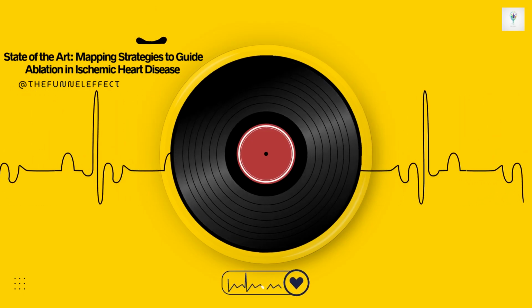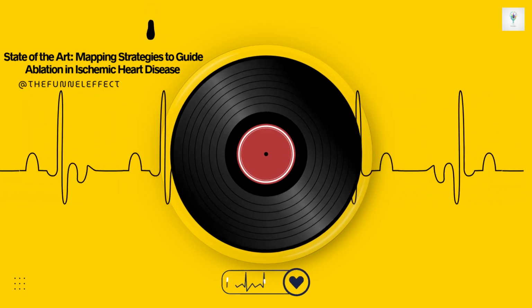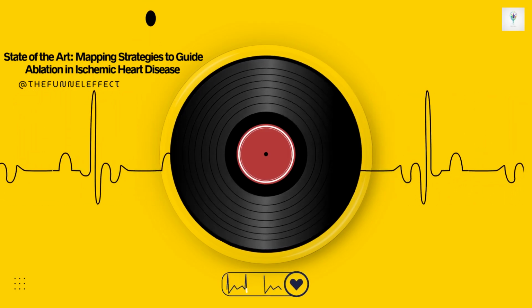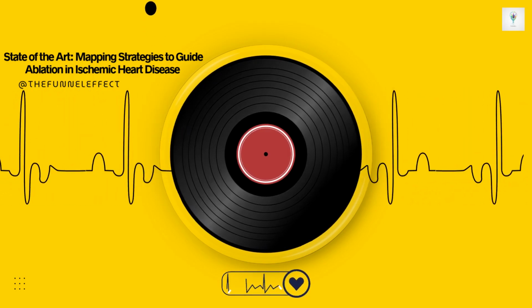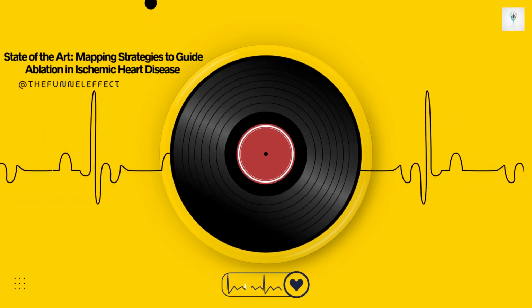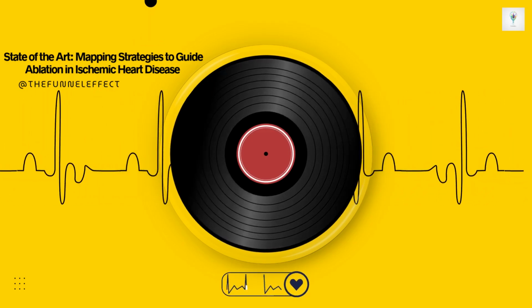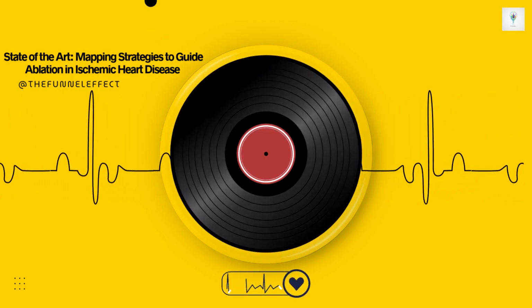Like if the VT is just running constantly, we call that incessant VT, or if a previous attempt using substrate ablation didn't work, the VT came back. Or sometimes you just need that absolute precision. It's this constant balancing act, speed versus risk versus how precise you need to be. That distinction, mapping the potential danger versus mapping the active fire, seems absolutely central.